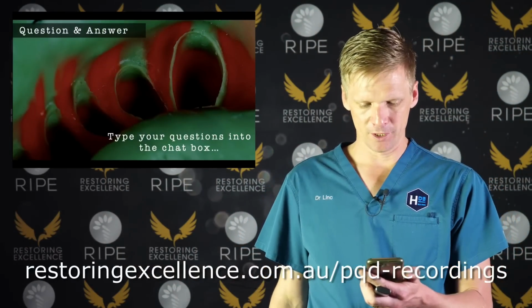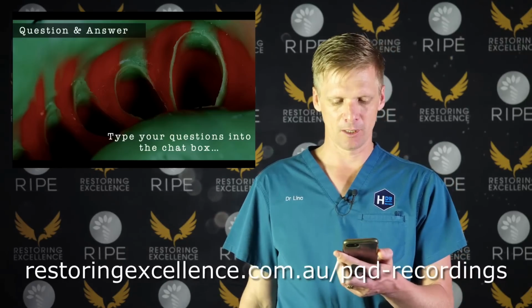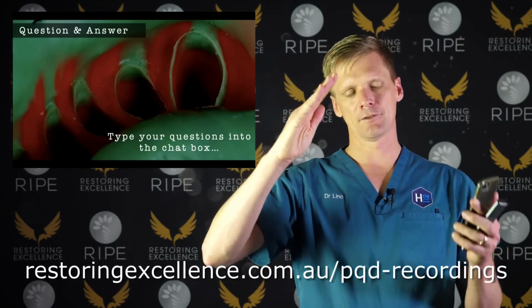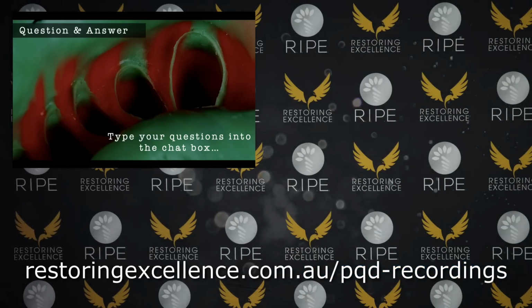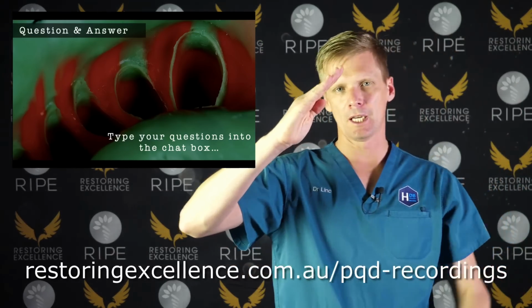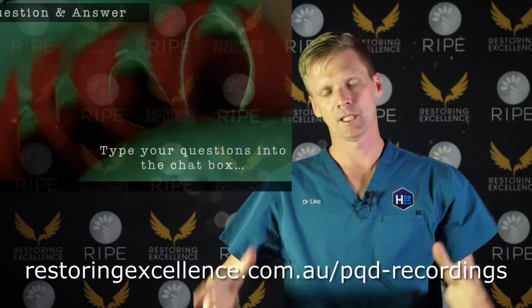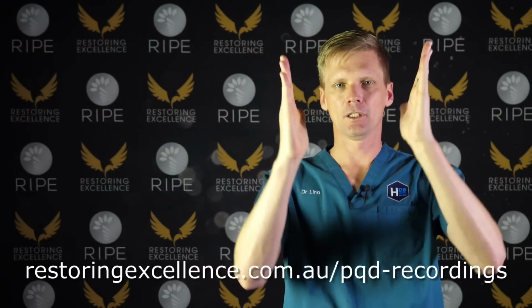Why do drags come on impression sometimes, especially when patients have anterior proclination? So if you've got anterior proclination, what happens is that your tooth leans forward like this, and you put the tray in. The silicone can't go round corners. Silicone is dead soft. It can only go vertical or out.